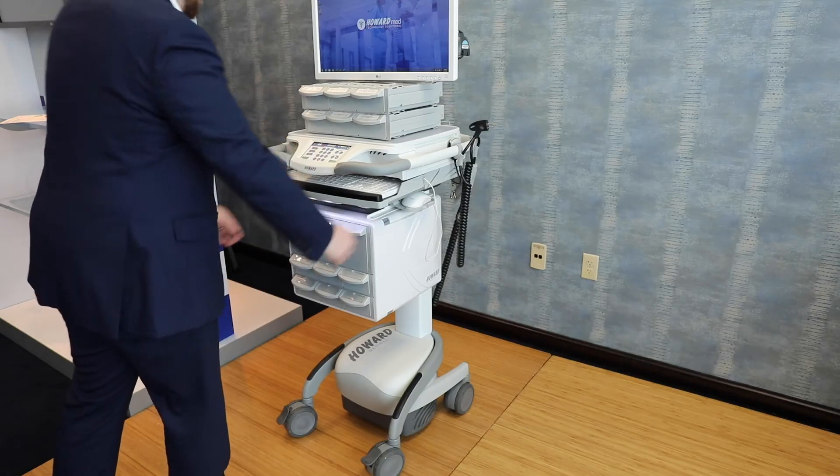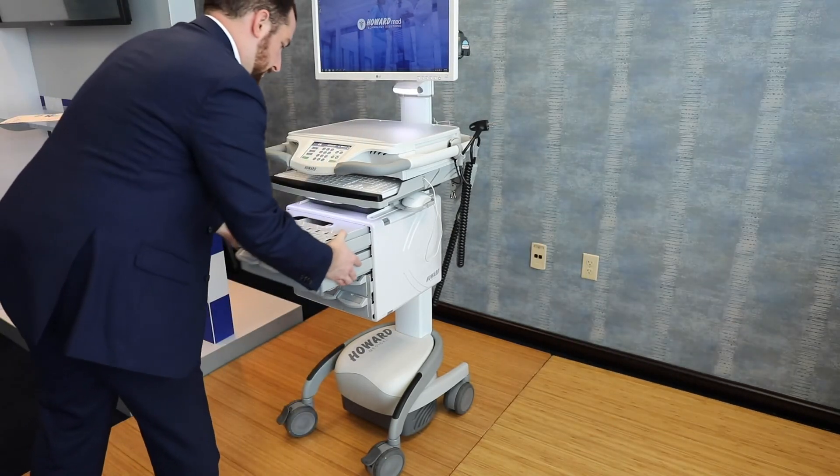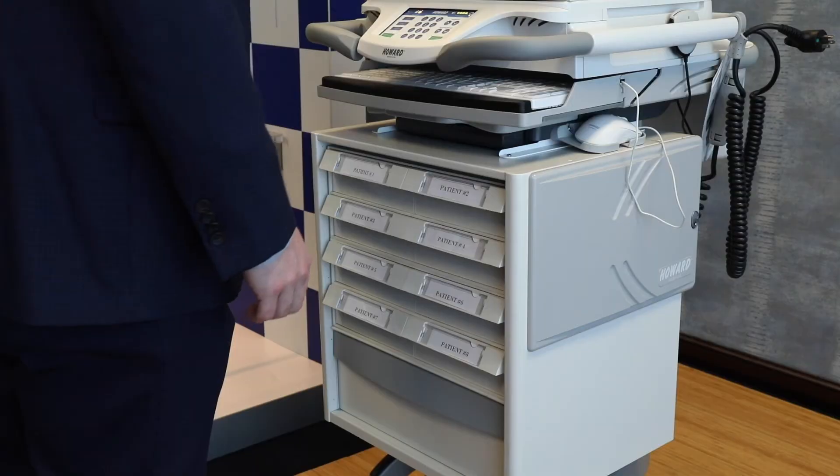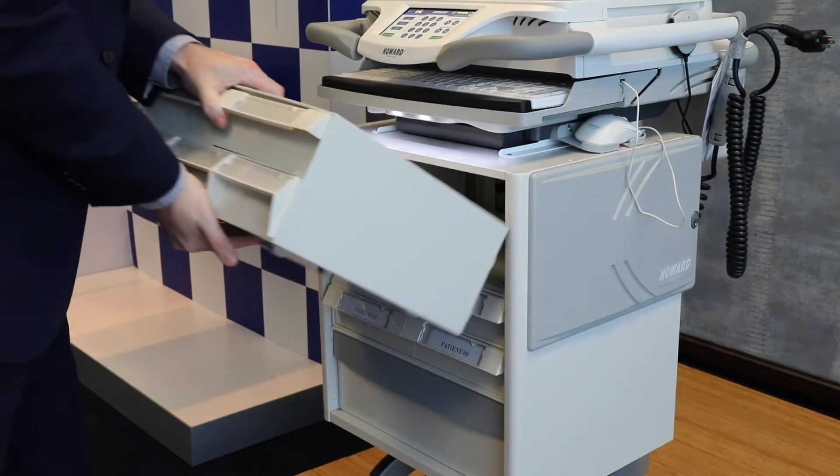In medication dispensing applications, users can exchange the drawer cassettes to meet needs from shift to shift. If you're using the Hi-Paradigm, your storage will look slightly different, but cassettes can be changed just like the Hi-Care E.